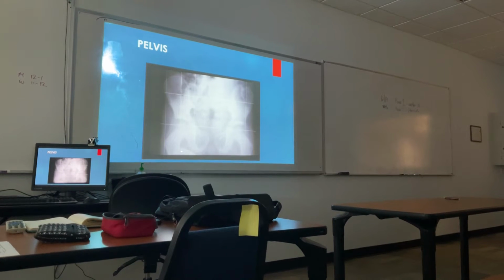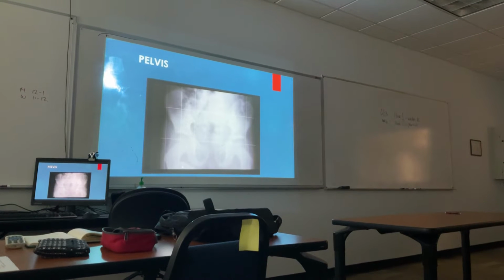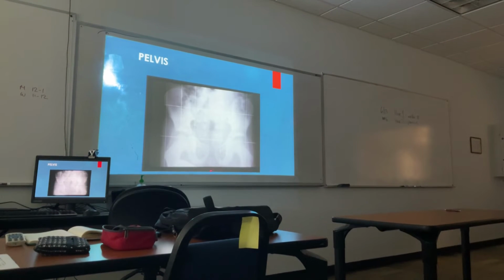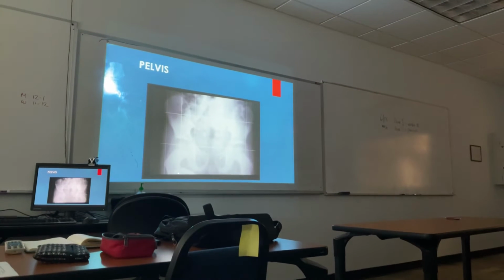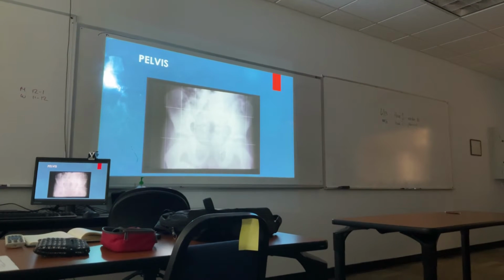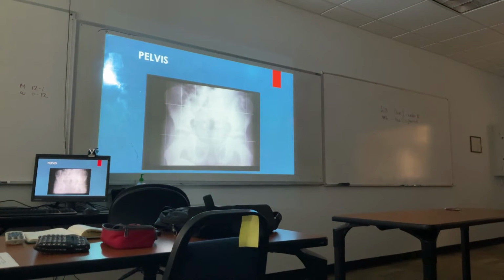It's metal, okay? Where's the metal supposed to be? Not there. Where's it supposed to be? Lateral, unless it's shrapnel. It's a gonadal shield. What's the point of the gonadal shield? To protect the reproductive structures. It's not where it's supposed to be. Okay, so if you're gonna use a gonadal shield, at least put it in the right place.